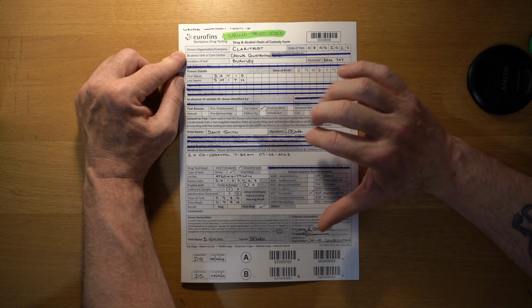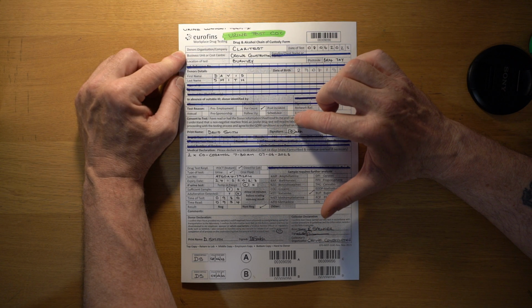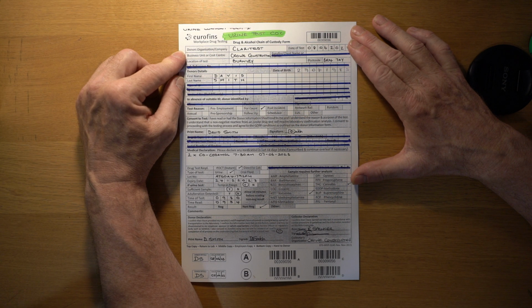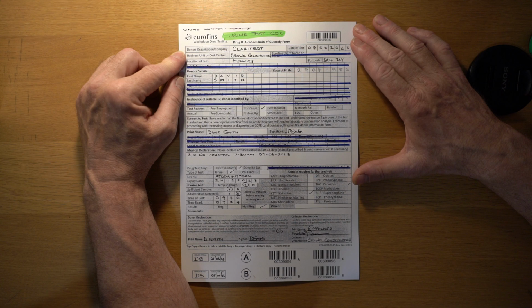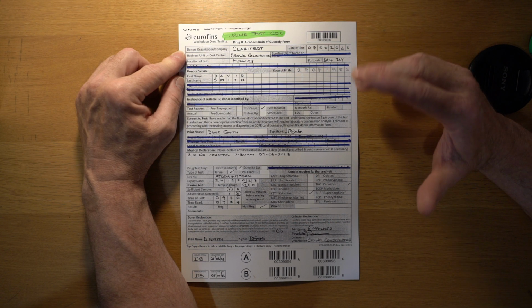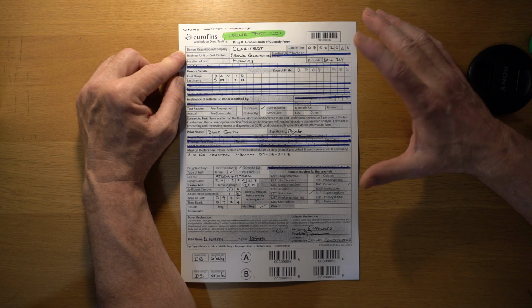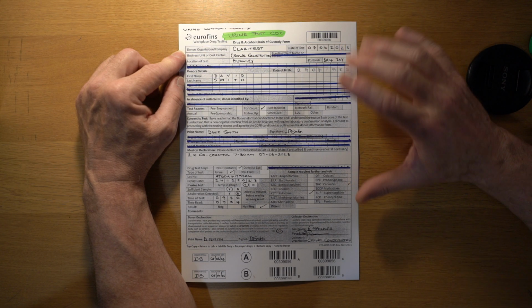I then printed the name and asked the donor to sign after reading the donor consent to test. So I generally read this to the donor rather than ask them to read it. There can't be any misunderstanding when we get to the end of the test when they say they didn't understand the statement, so I read it to them.